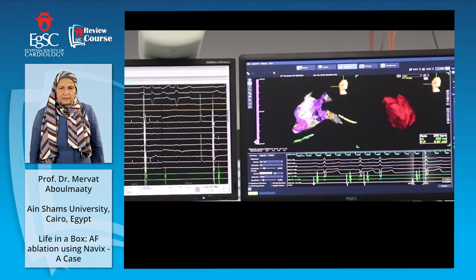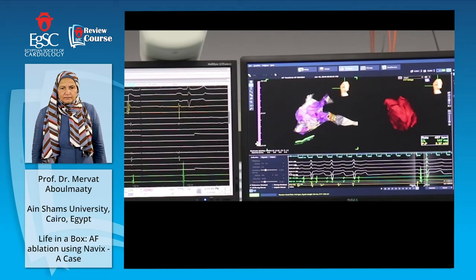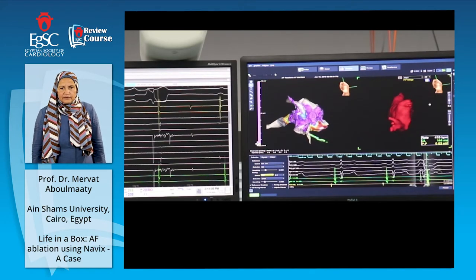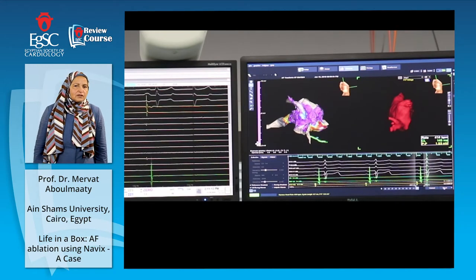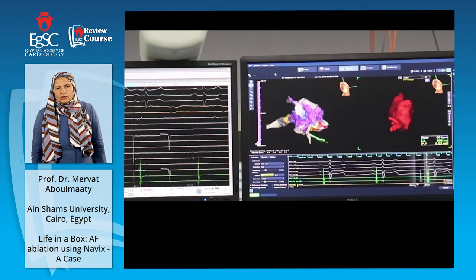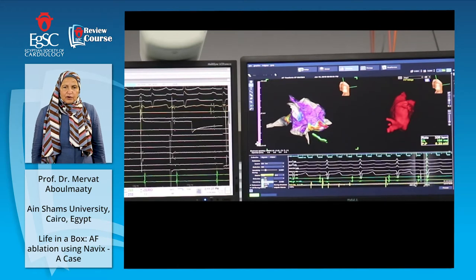Here I'm repeating the step I showed before, which is getting signal from the left superior pulmonary vein. Yes, how it looks like here. This is the ablation catheter in the left inferior pulmonary vein, getting signals. And you can see the electrical signals are shown on the side screen. I compare what I have with the CT in order to go to every single vein and to get a good volume of the vein, good size and shape of the left atrium.